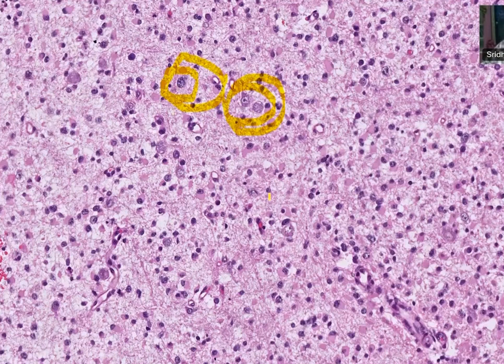Sometimes you can see similar cells here. You see this? I'm marking them out. Those cells are different; they're probably caught-up neurons. So that itself tells you that it has replaced the native parenchyma and is diffusely infiltrating. And what else will you describe in this field?